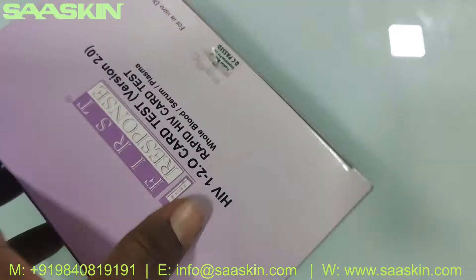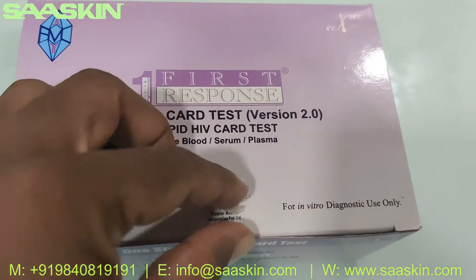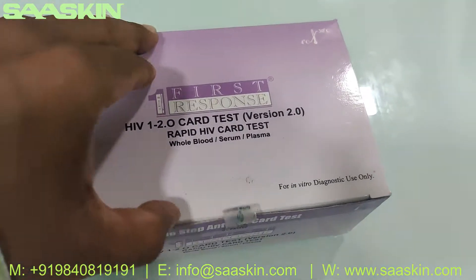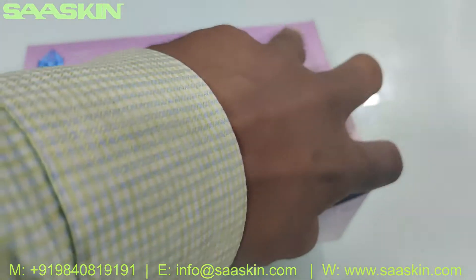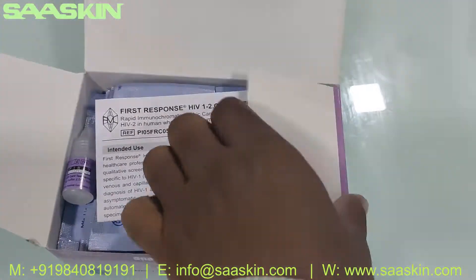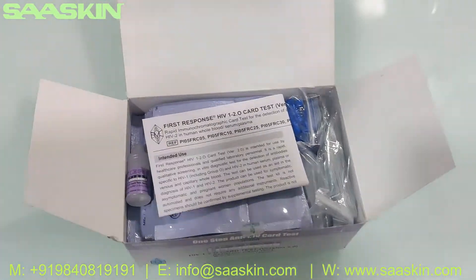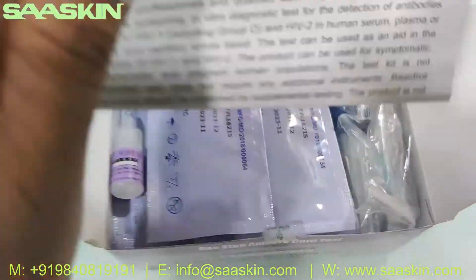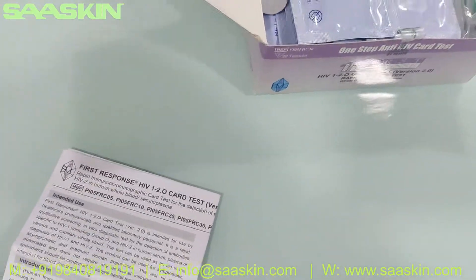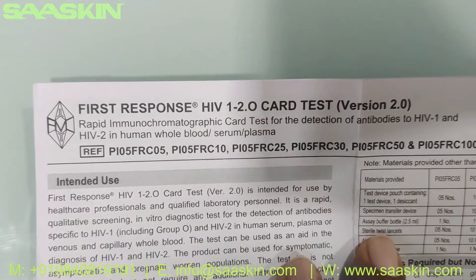Let me just open this box for you. This is how the total kit looks like. Inside the box, you get an IFU brochure — that's the instruction manual.